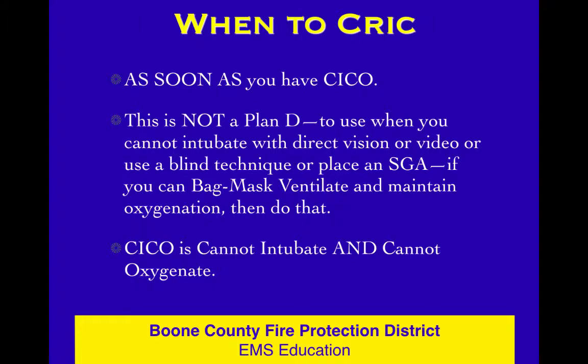So when should you crike? And the answer is as soon as you have cannot intubate, cannot oxygenate. It's not like you're going to try oral intubation, and then video, and then a supraglottic, and then a bag mask, and if you can't get him intubated with any of that, then you're finally going to go to a crike. It's not that at all. The moment you can't intubate your patient, and therefore can't oxygenate your patient either, you've got to go immediately to a crike. And so that's pretty much the plan.